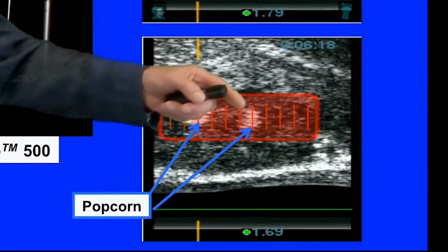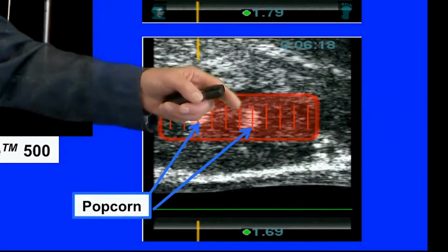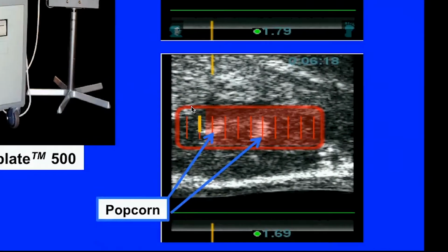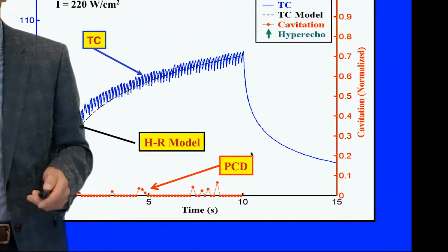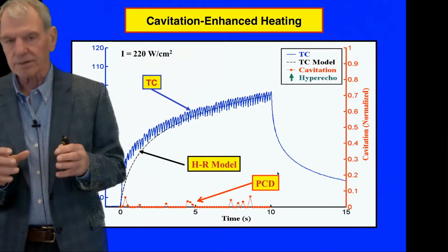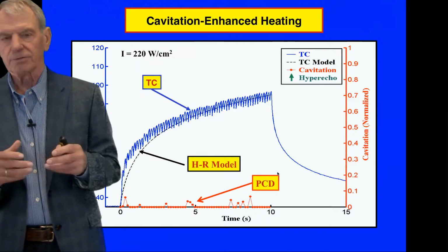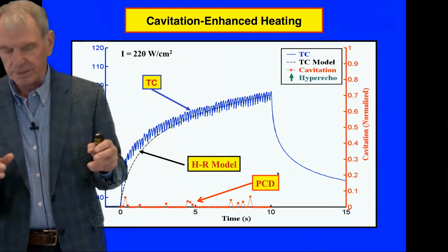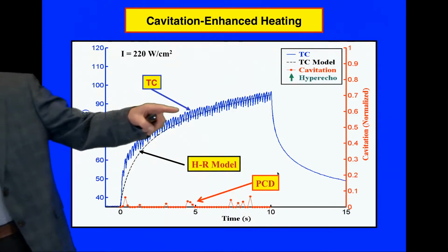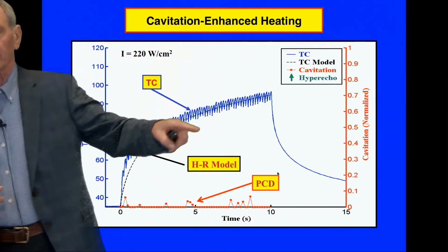And these cavitation and boiling generate, cavitation-induced boiling can be problematic in terms of treating the tissue. So when you apply acoustic field to tissue, you have two things going on, or could have. One is you're going to heat the tissue up, as we have demonstrated here. And you can model that quite well.